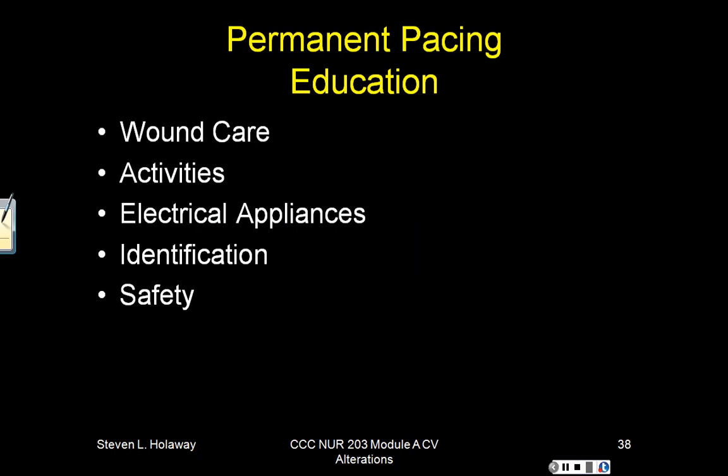So when we talk about pacemakers, we talked about causes, we talked about the different leads, and we talked about the types of pacemaking. There's temporary pacemaking, permanent pacemaking. As we talked about temporary: transcutaneous, transvenous, epicardial. Again, we'll talk more about epicardial pacing as we talk about cardiac surgery, but very, very important.